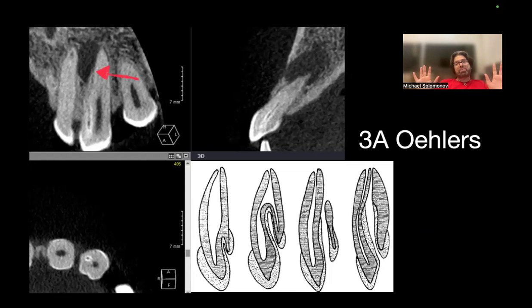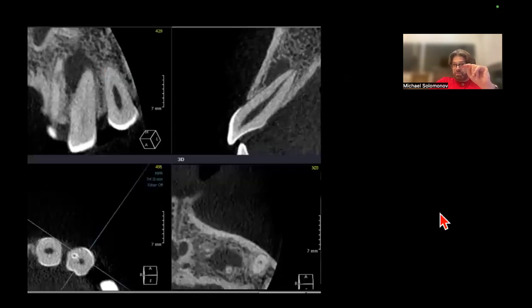Of course, one possibility is a false positive. It happens. But in this specific case, please see now this scan, and suddenly you understand that we have no lesion on the apex of the main canal. All these lesions are from the dens.